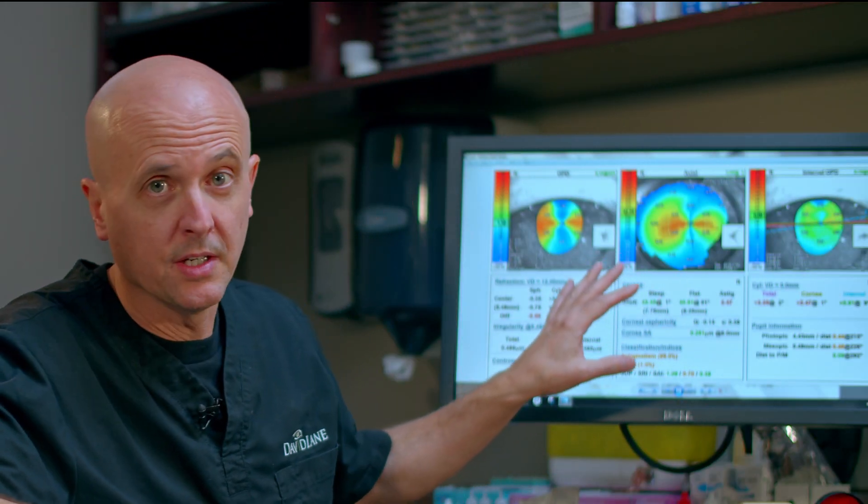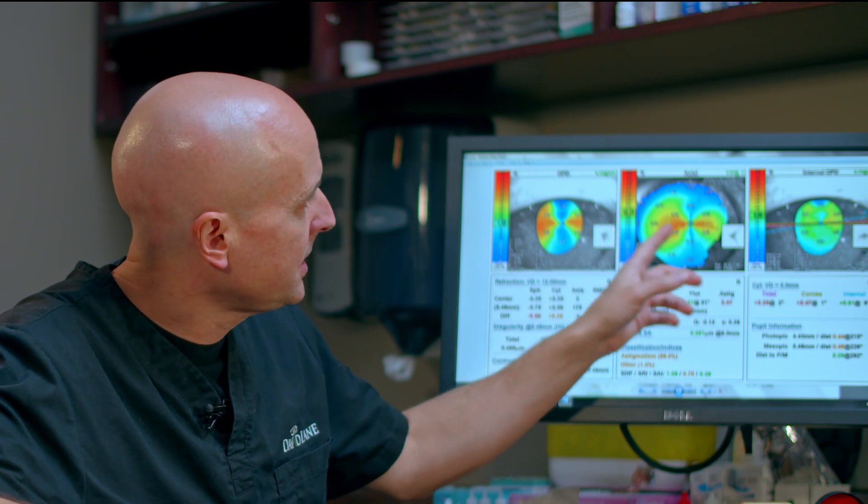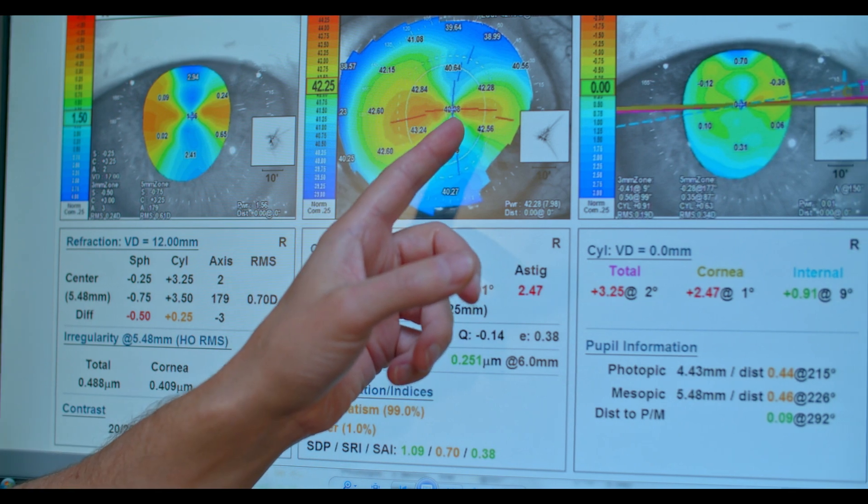Just looking at this picture here — this is a special picture showing the scan or shape of the front of the eye. If you see this orange or yellow bowtie pattern, that's the astigmatism shape.